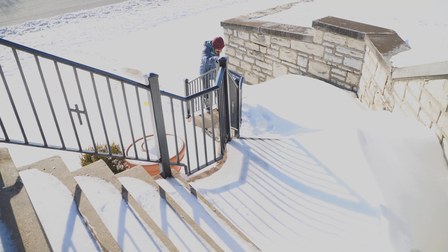Be careful and hold on to your handrail. See that — my knee is sliding out from under me. There we go — look at the ice. If I were to just step right here it would just slide into the ice. I actually feel safer going backwards on this.